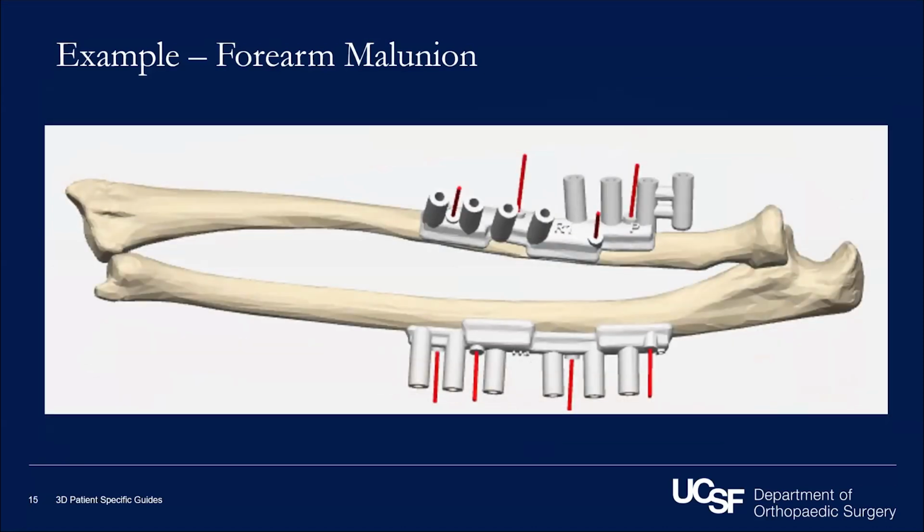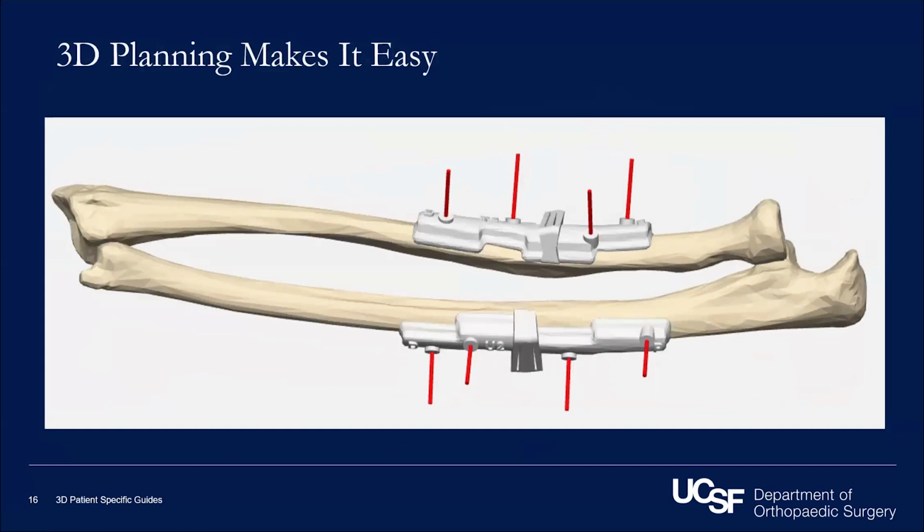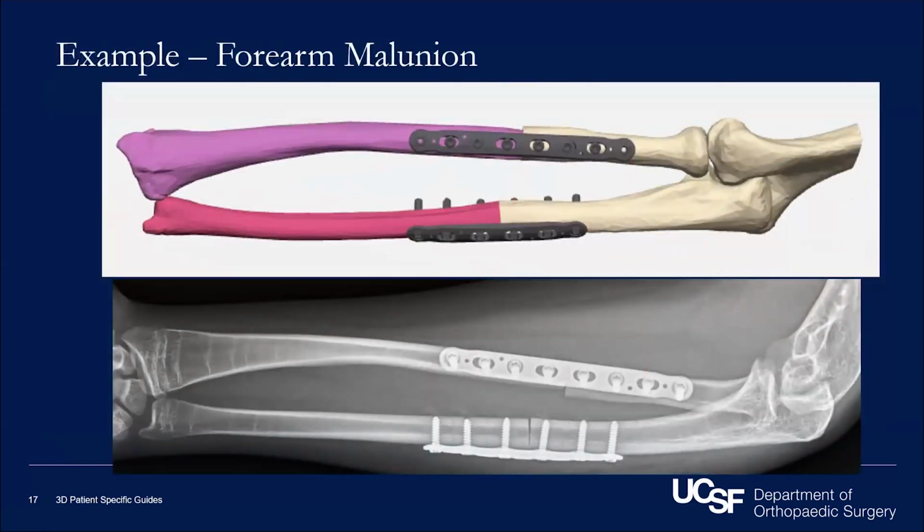We can design the guides. So we pick what hardware we're going to use, and basically we pre-drill. We plan that we're going to pre-drill for the hardware to realign the bone. And here we're designing the guides to do that. You can really see the rotational correction built in on the radius. And then here's the guide designed for the cuts. So this is a guide for the osteotomy. And then you can simulate what it's going to look like. And then the final product you can see there on the x-rays.